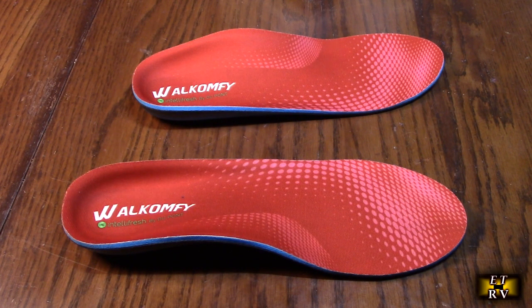These get excellent customer ratings — people really seem to like them. They have high resilience memory foam, a new generation TPU arch support insert, Pro Run heel support shock absorption, and full length soft and medium hardness EVA foam. They also absorb sweat and are very breathable.